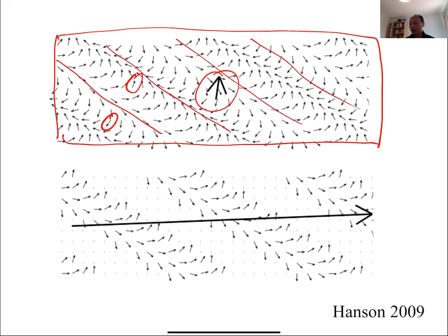Now let's consider, just in this case, where there's no spins, it's like I've cut the chocolate in diagonal stripes out. So there's really no spins there, and so that's all zero.